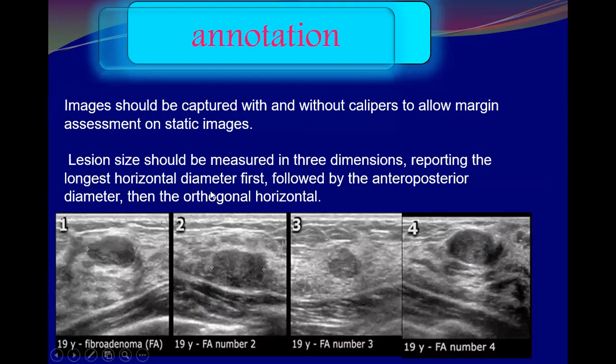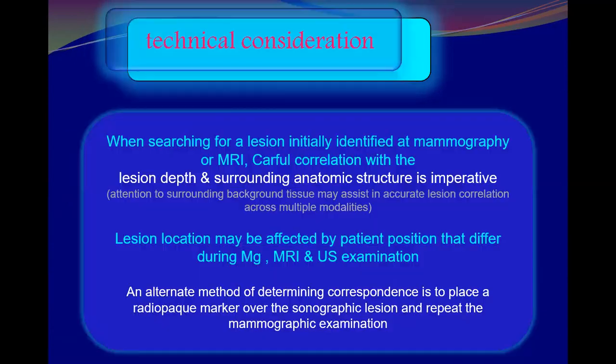And we have to document the image with measurement and without measurements for the lesion. Not to take all the images just with the measurement and that is it. For the same lesion, you have to have an image with measurement and an image without calipers, without measurements.